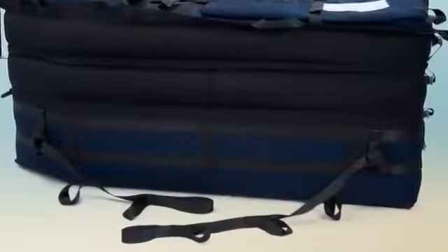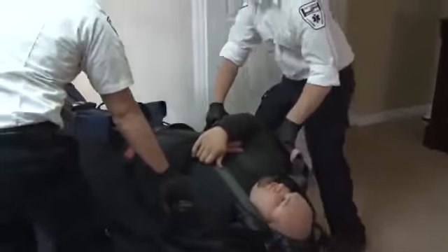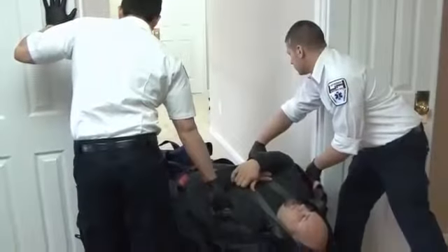Using the foot end steering straps and the transport handles, move the patient on the inflated Evacuation HoverJack 2 to the widest stairwell available, positioning the device so that the patient will be transported feet first down the stairs.